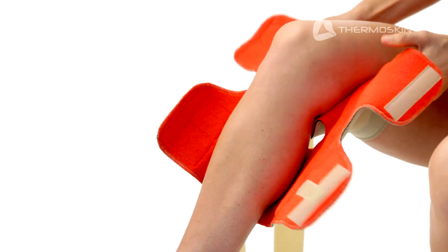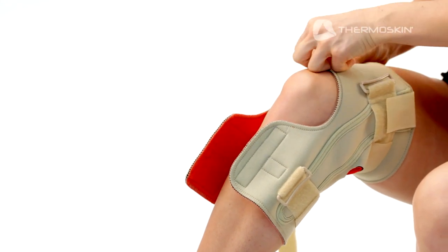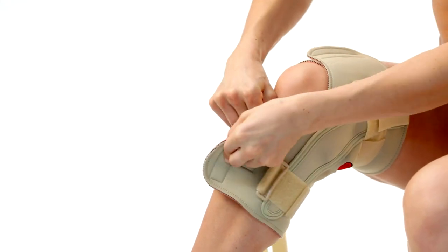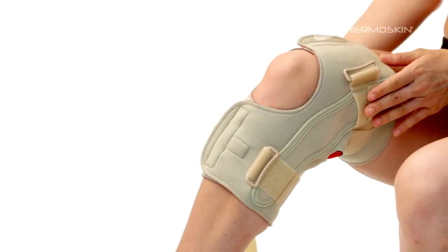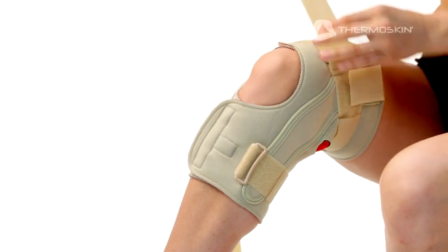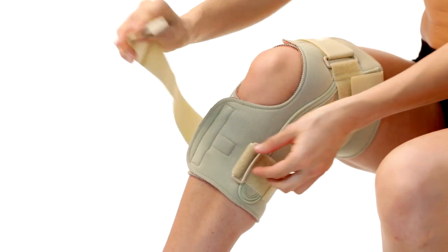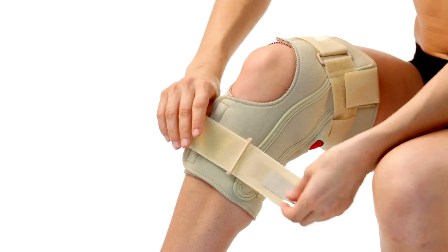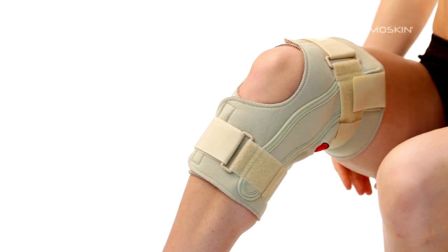Wrap the short top straps over each other and secure the fastener above your kneecap. Wrap the short bottom straps over each other and secure the fastener below your kneecap. Then thread the long top strap through the top buckle and back on itself, firmly securing the fastener. Next, thread the long lower strap through the lower buckle and back on itself, securing the fastener to keep the brace firmly but comfortably in position.